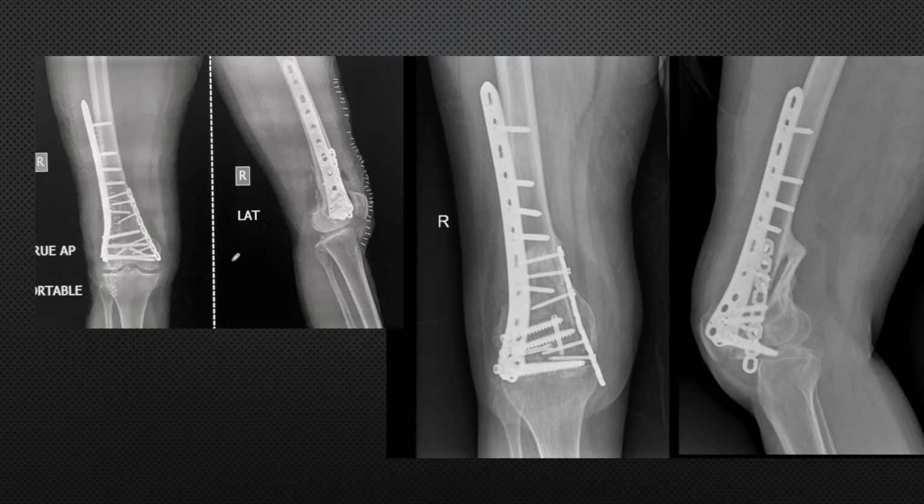Another patient you'd see, again the surgeon tried to be biological by just putting 2 plates. He avoided placement of any plate in this zone. Now you see the outcome. I told you the forces are high on this zone. If you are not addressing these components, they will displace. So the same thing happened. The plate remained in place, but the posterior condyle has displaced. So the spikes need to be neutralized with some kind of stable fixation.